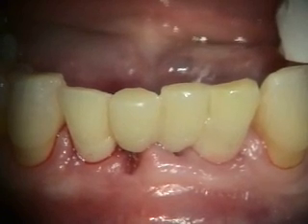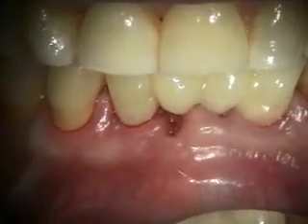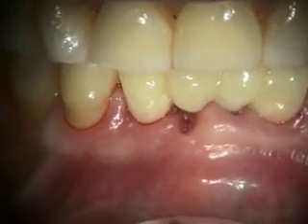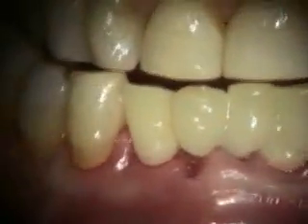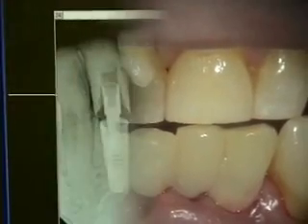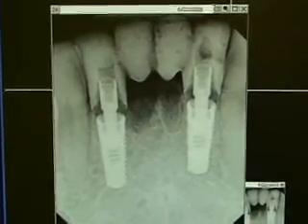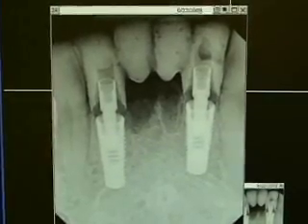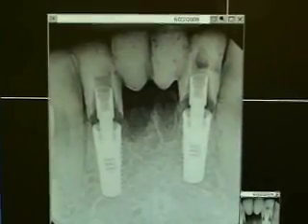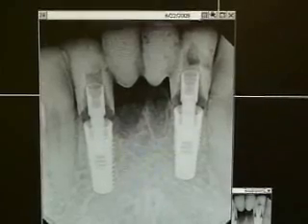We've grafted the 24 and 25 sockets and placed implants at the 23 and 26 sites and made our provisional. Taking a look at his occlusion — he has really no occlusion here but he's a pretty severe grinder and bruxer. We've got that cleared in protrusion as well. He wears a sleep apnea appliance, so we'll be making sure that's working too. Here are our two immediate implants with our immediate provisional. We checked his night guard — it's free and clear. It's a sleep apnea appliance with an upper and lower with a hook to pull the jaw forward, and it had already been adjusted out of contact with these teeth. We're going to take a look at things in a couple weeks.